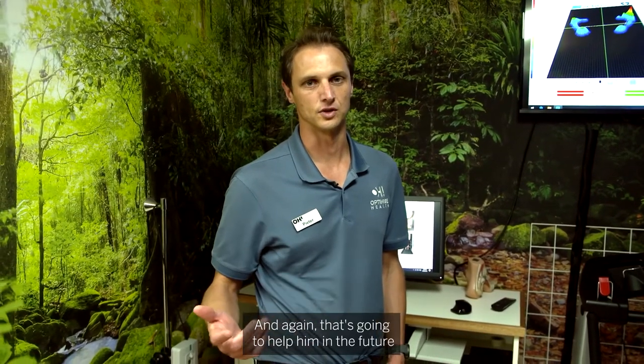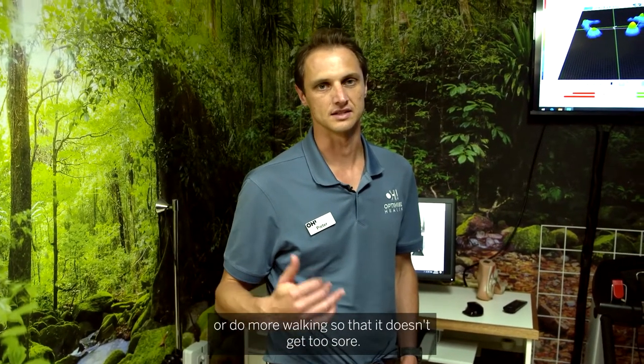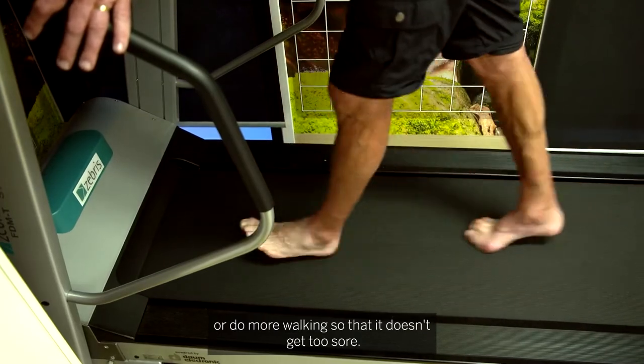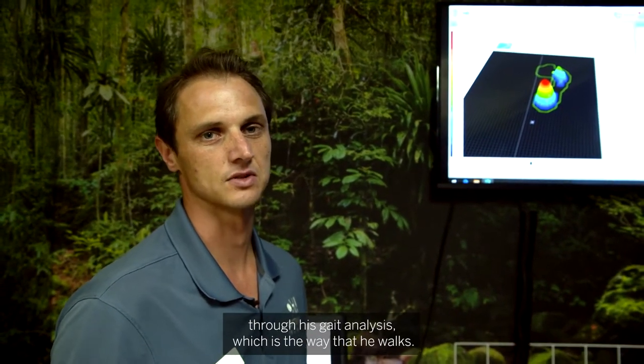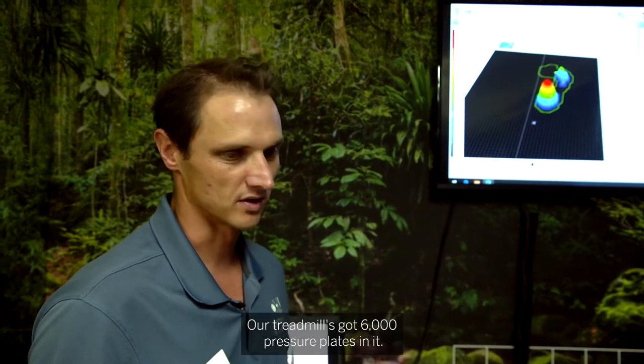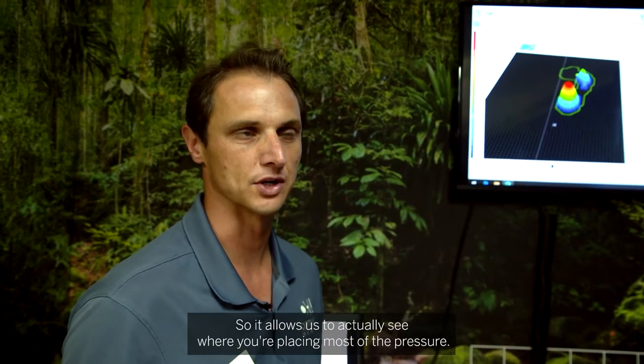That's going to help him in the future when he wants to play more tennis or do more walking so that he doesn't get too sore. At the moment we're working with Paul through his gait analysis, which is the way that he walks. Our treadmill has 6,000 pressure plates in it, so it allows us to actually see where you're placing most of the pressure.